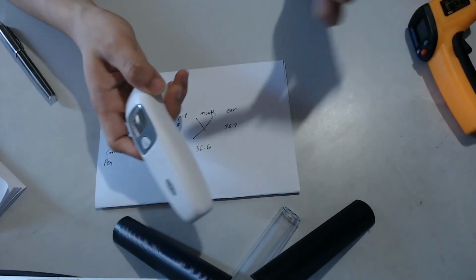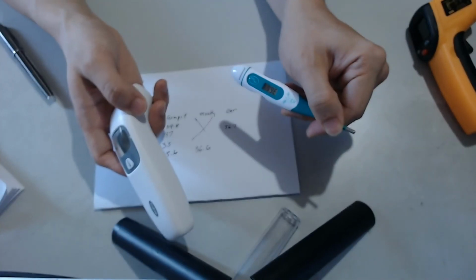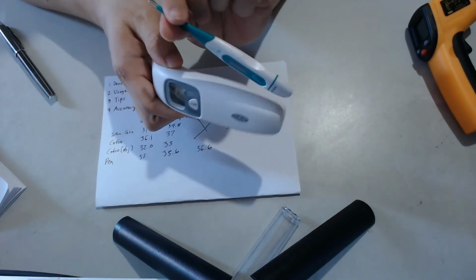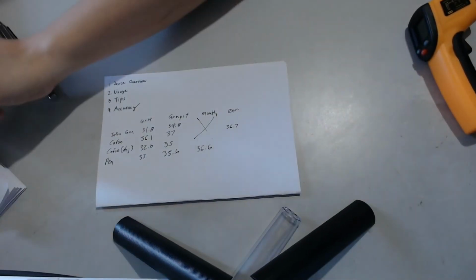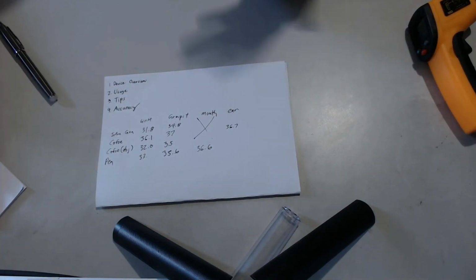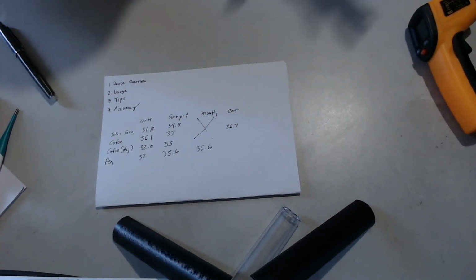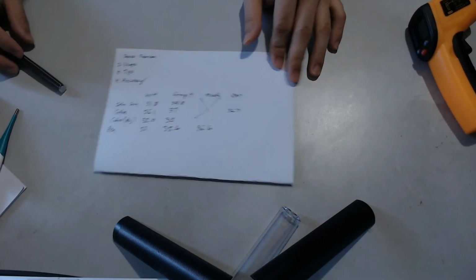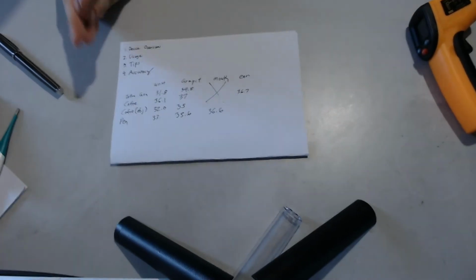So this is comparable to measuring with a pen thermometer in your mouth. So compare it against your mouth. If you're going to measure this, make sure you take the mouth temperature using the pen thermometer to make it more comparable. This is an unscientific experiment because ideally you would measure it 5 times across different people, etc., to form a good sampling of the population. But this at least gives you an idea on what not to measure it against.